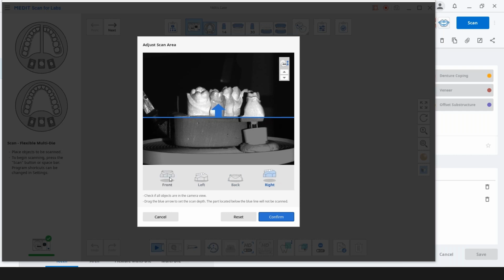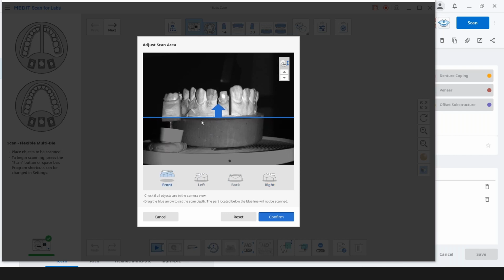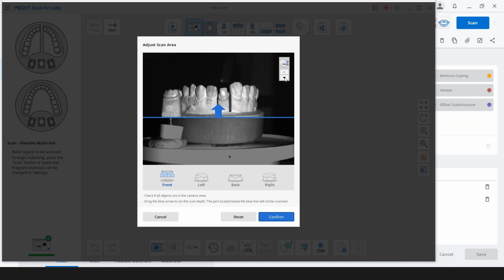Now, commonly you won't need that because you're going to try to mount it as flat as possible. And you definitely don't need that if you're just doing dies, like on a multi-die plate, because it's a circumferential 360 view. You don't have to worry about that. So if I did want more base here, especially if I have models that are articulated in the last step that you'll see, I may have too much base or not enough base. And I kind of want to get the midline just right in the middle. So I have these options here to move this up or move it down.